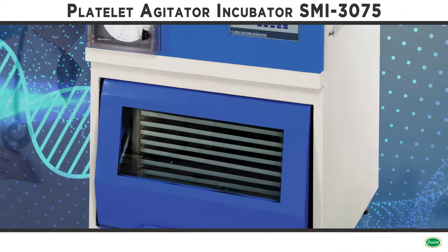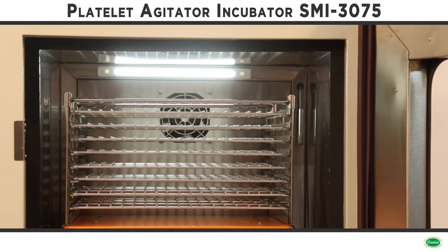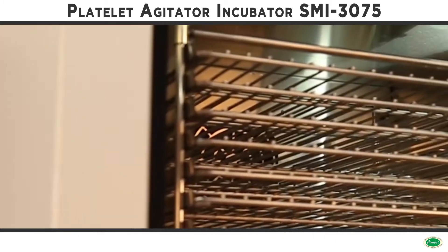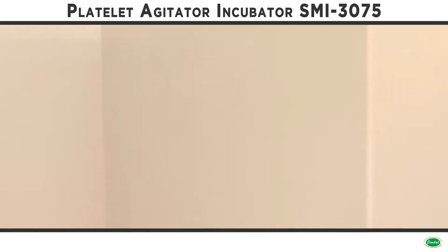Complete platelet systems incorporate one of our heavy-duty platelet agitators inside a platelet incubator. They are supplied complete with no extras to worry about. The platelet incubator uses state-of-the-art technology to achieve reliable control over temperature.